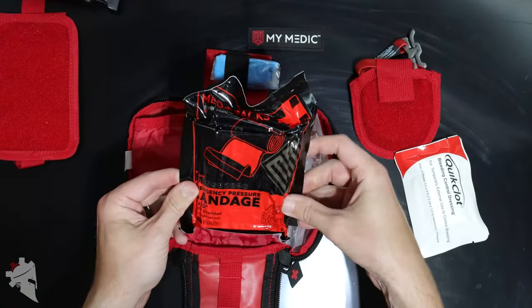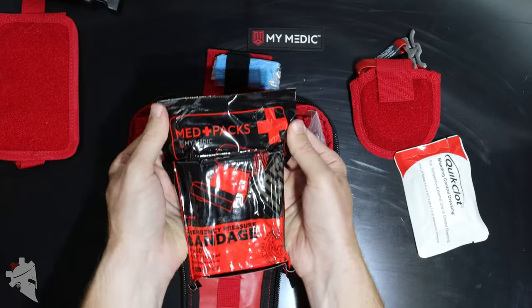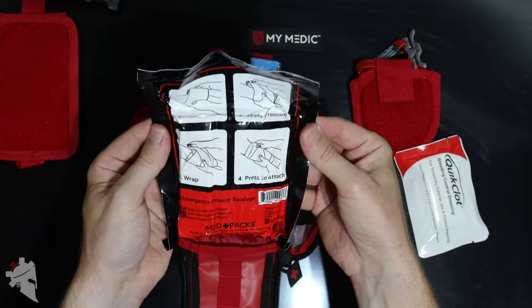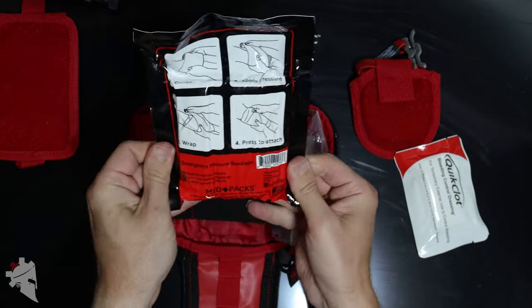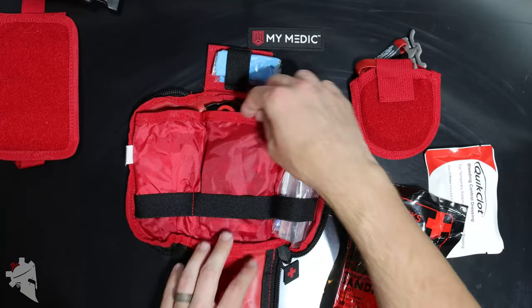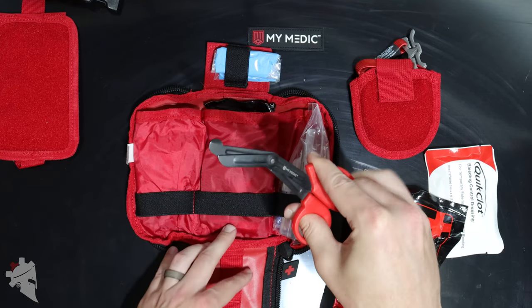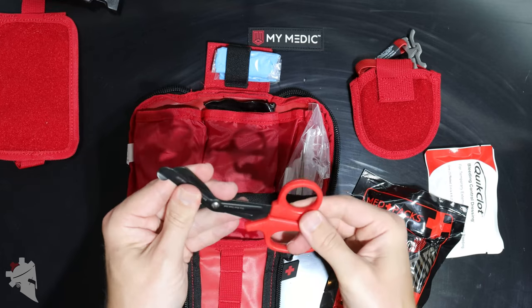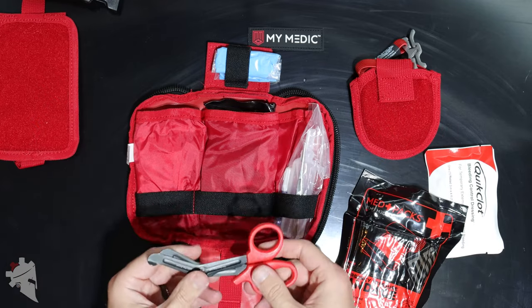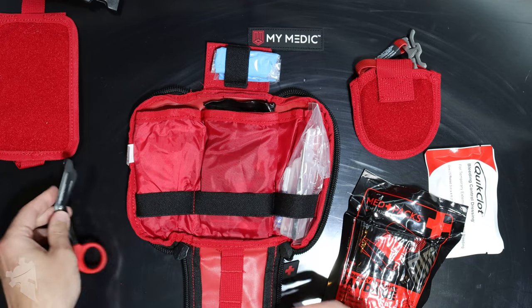Next up is the emergency pressure bandage, branded from MyMedic, and it is vacuum sealed. This is a pressure dressing which can also be used as a sling in the event of a broken arm, for example. After that, we have trauma shears, also branded MyMedic — they seem pretty solid overall, not super flimsy. They are a little bit small, but then again the entire kit itself is fairly small, and they seem like they'll hold up pretty well.